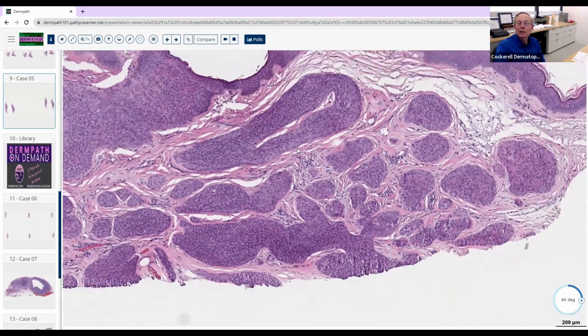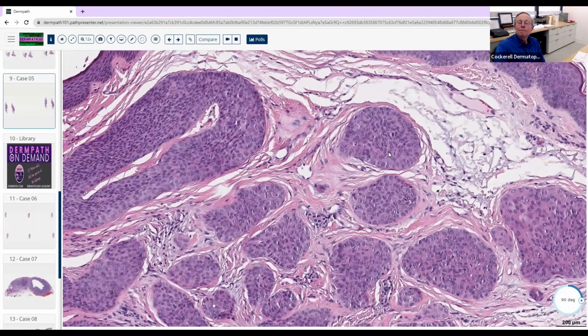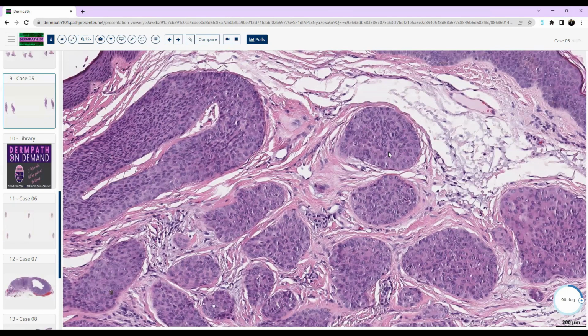What kind of criteria do you usually use? If something's non-epithelial, what do those cells usually look like? What shape are they usually? Like cuboidal. They can be, but mostly what? Like here's a non-epithelial cell up here, right?